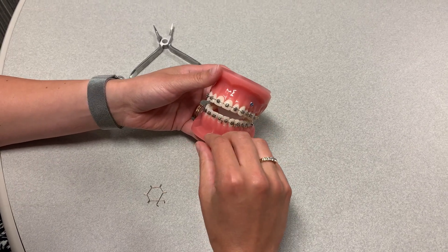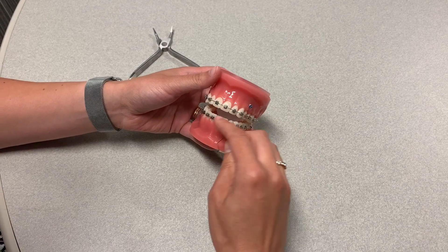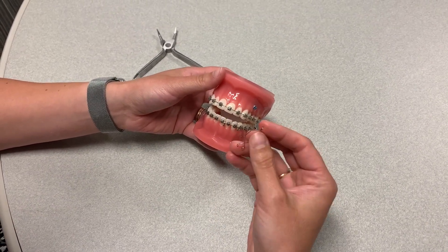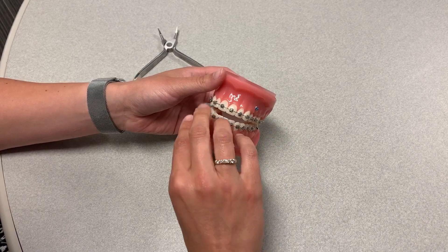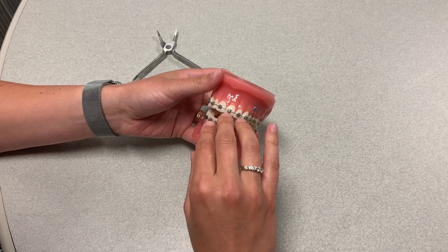We're going to demonstrate installation of a maxillary medium art spring onto this typodont. The maxillary medium is the most popular size. In this example we're going to assume that this Empower patient requires de-torquing of the upper arch.